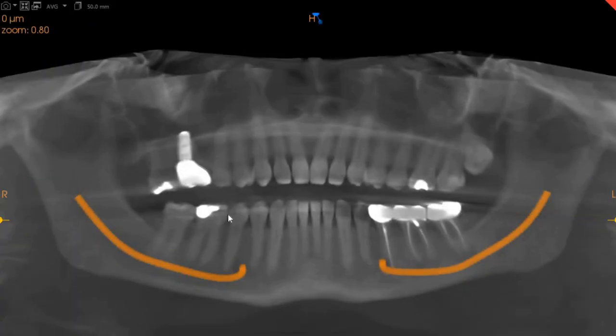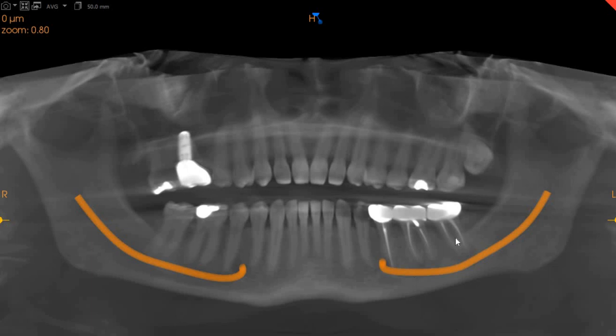On the panoramic view, we can see that the lower right 7 is carious but not endodontically treated, and the lower left 6 and 7 are endodontically treated with periapical radiolucencies.